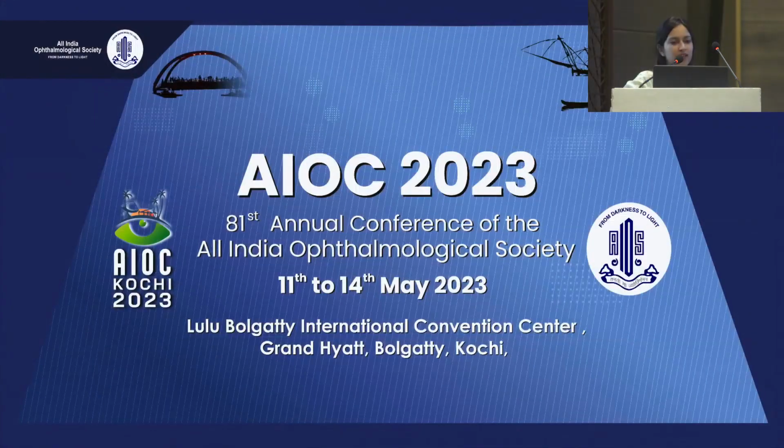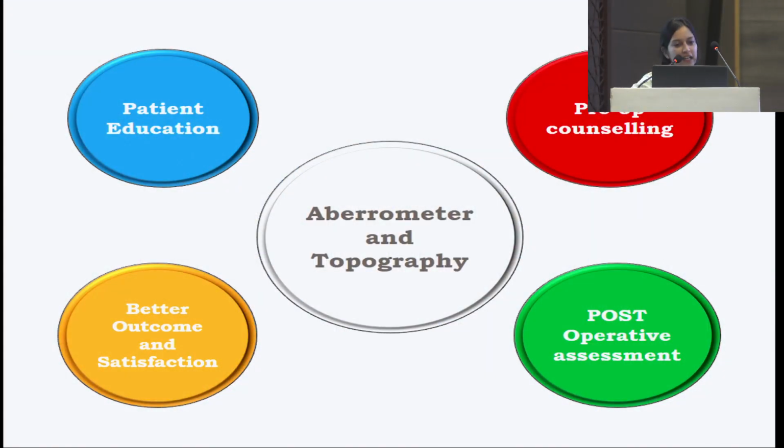So thank you very much. I would just conclude that aberrometry and topography can help with patient education, preoperative counseling, better outcomes and satisfaction of the patients, and postoperative assessment as well.